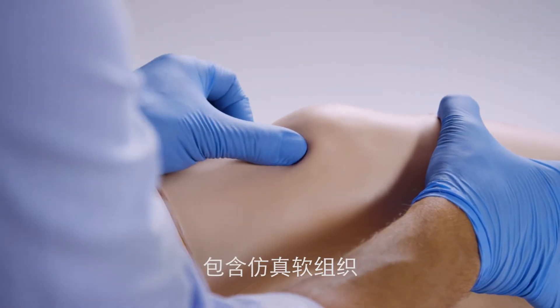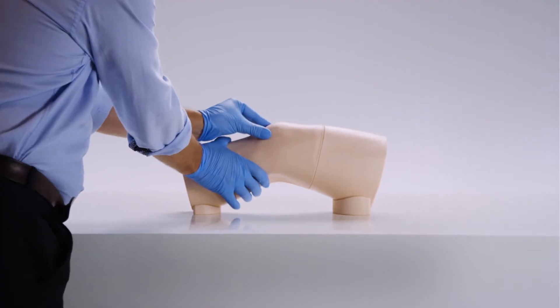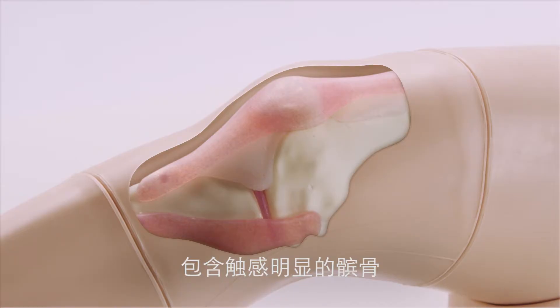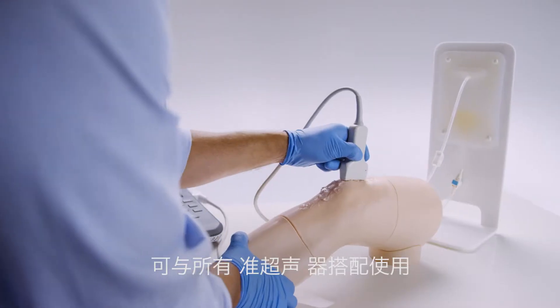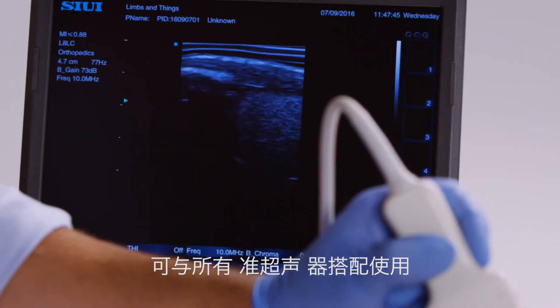Realistic to touch, it includes synthetic soft tissue and bony landmarks. Beneath the skin lies accurate internal anatomy and a palpable patella. The proprietary echolucent material allows the knee to be used with all standard ultrasound machines.